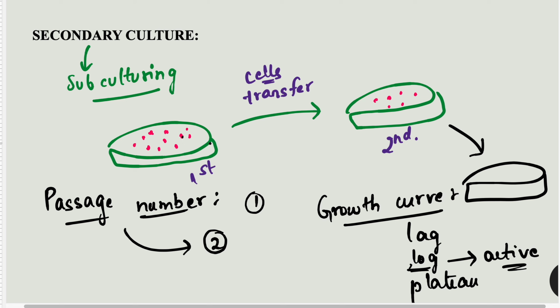As the cell concentration exceeds the capacity of the medium, then it's time to subculture. The medium should be changed. If the cells increase more in number, exceeding the capacity, the medium needs to be changed. Okay. Next we will see the types of subculture.